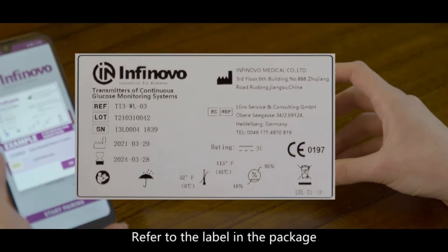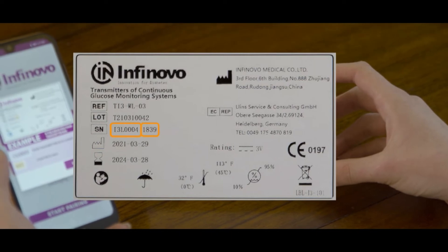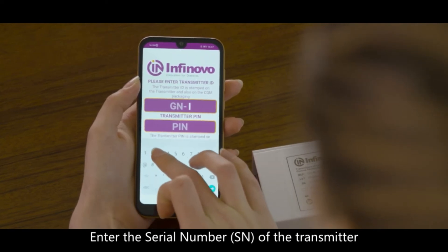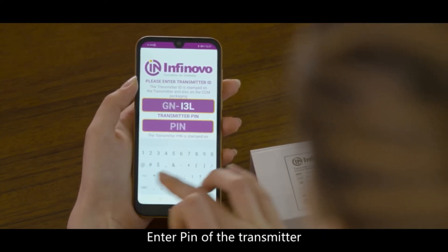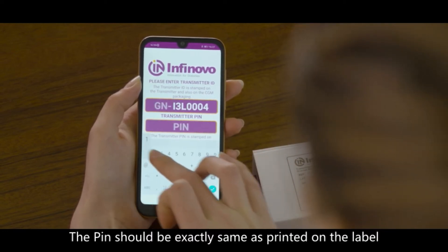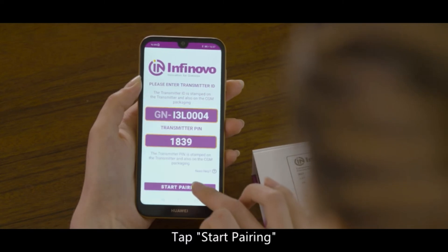Refer to the label in the package and get the identical information of the transmitter. Enter the serial number of the transmitter. Enter the PIN of the transmitter. The PIN should be exactly the same as printed on the label. Tap Start Pairing.